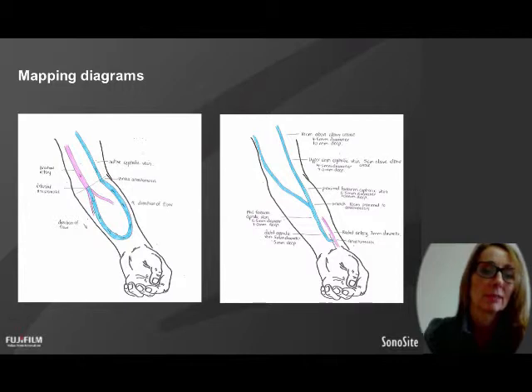So on the left is a PTFE graft. It tells the staff the direction of the flow, so that helps them knowing which is the arterial and which is the venous. It just helps them to understand if there are any issues, or if they see something new like a collateral off the outflow, they might be able to identify that something's changed if they rescan it later on.